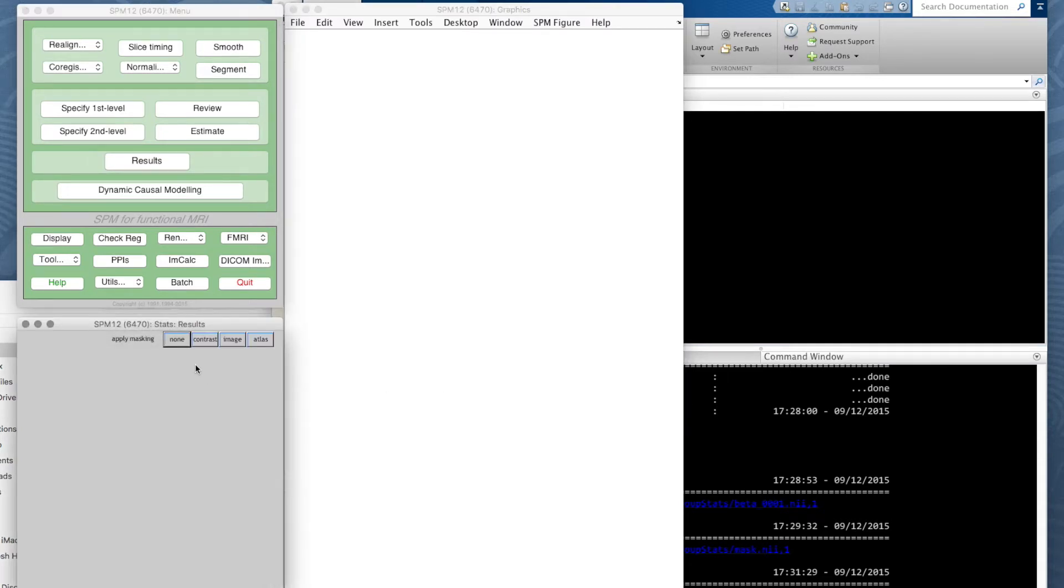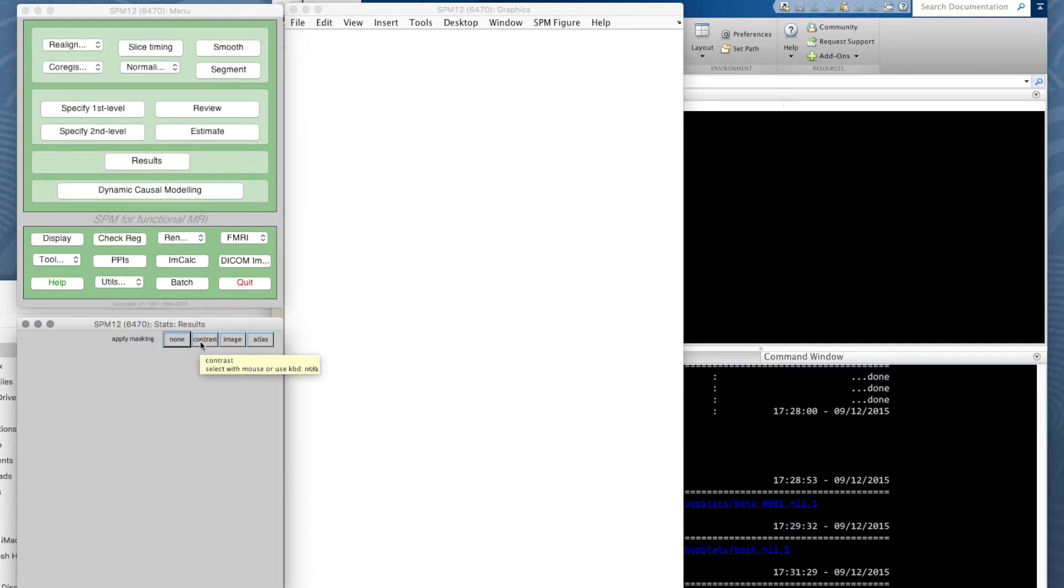We're asked if we want to apply masking, and the options there are none, which is the default, contrast, image or atlas.